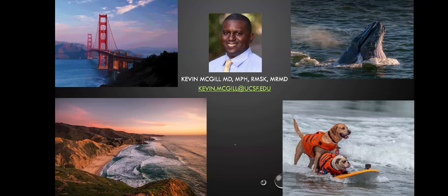Okay, thank you so much. We'll go to a question from Dr. Pua. Hi, Dr. McGill. What is our threshold for grade 1 ATFL injuries? Sometimes it's as subtle as an intermediate signal only on T1.